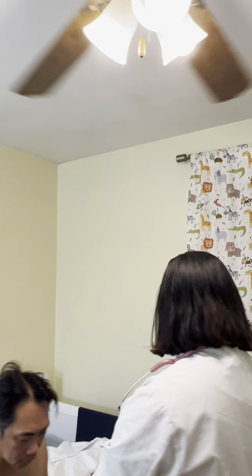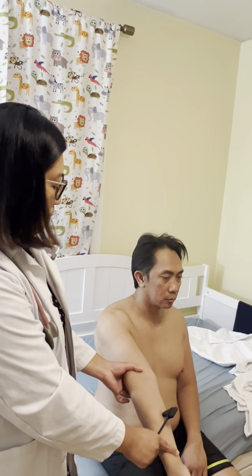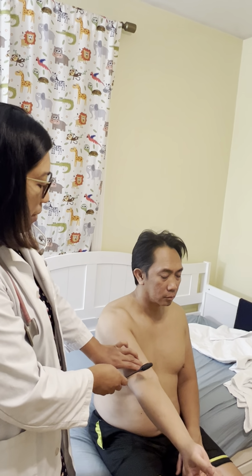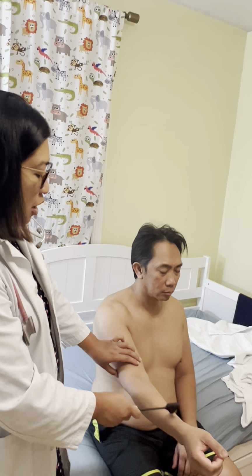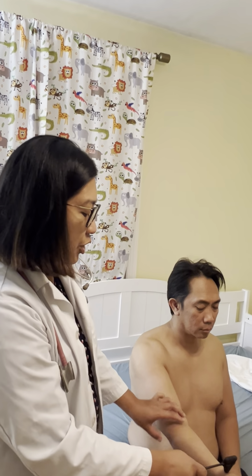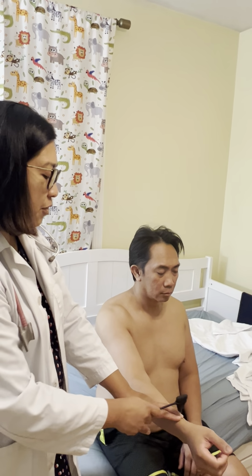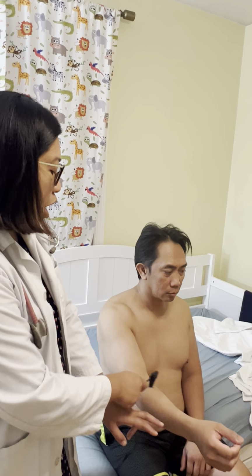Then we'll proceed with the reflexes using my hammer. So I'll do first the bicep reflex. Let the patient dangle. I will just locate the biceps. I will put a blow, noting for jerking movement of the forearm and contraction of the biceps. Then I will proceed with the brachioradialis, 2 to 3 centimeters above the wrist. I will put a blow, noting for any jerking movement or contraction of the forearm.